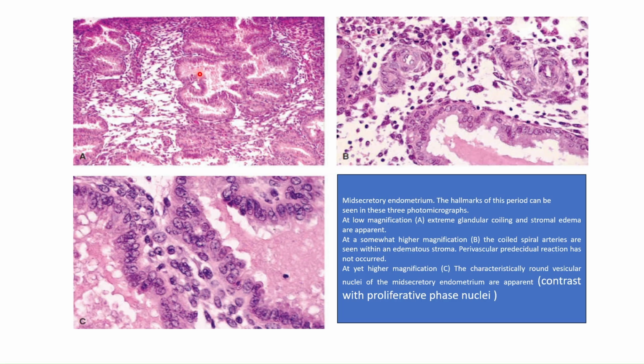Now, mid-secretory phase, hallmark features in these three diagrams showing its low power.